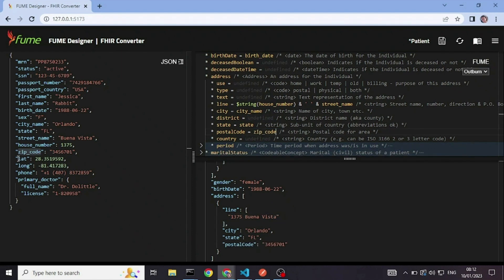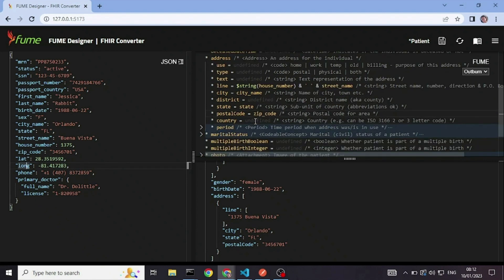And I have the lat and long, which is a little bit more advanced because it requires an extension. So it will not be in this video. But the phone is simple enough.